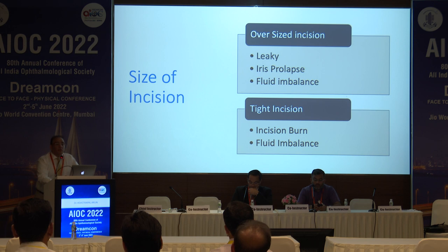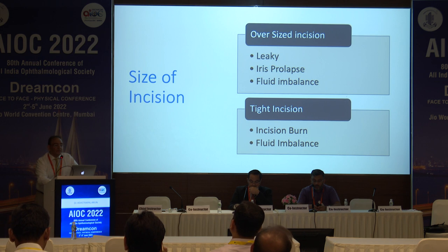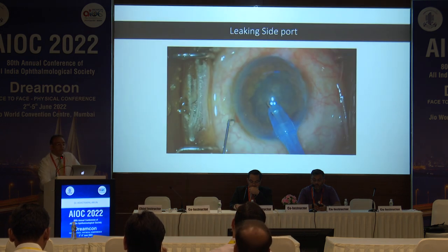The other way should not be there. There should not be a tight incision. A tight incision can give rise to incision burns and again fluid imbalance. So the amount of fluid going into the eye will be less as against the fluid which is being aspirated. So the incision size should be appropriate.